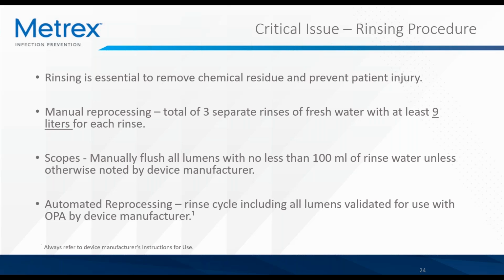For an AER, the preset rinse cycle may be used so long as the rinse cycle has been validated by the AER manufacturer for use with OPA-based disinfectants.